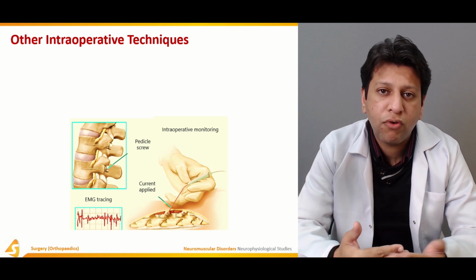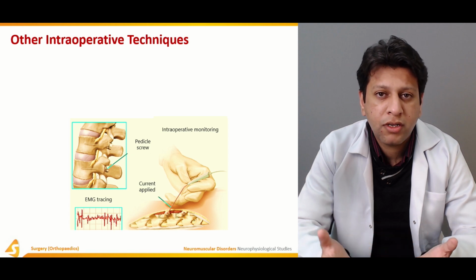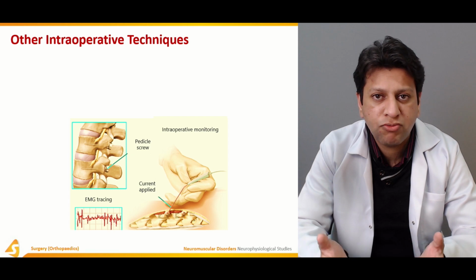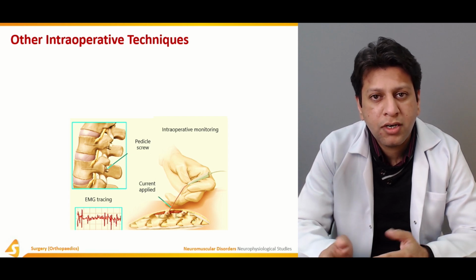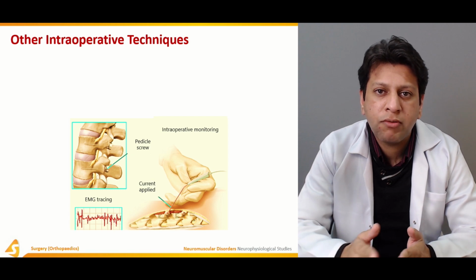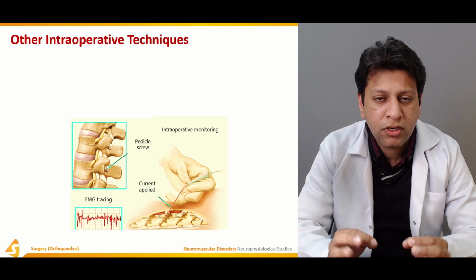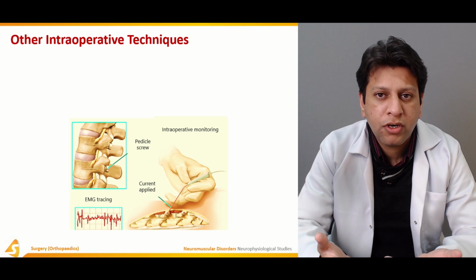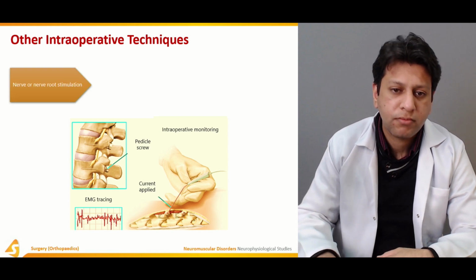The techniques have evolved in which intraoperative monitoring can be done through the use of specific small pin electrodes, like we are using for EMG, and they can later be documented in tracings, and amplitudes, frequency and latency can be documented on paper. So during the operation it's very easy to do the neuromonitoring without waking the patient up or partially waking the patient up from anesthesia.